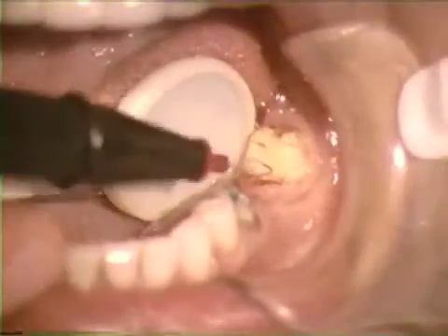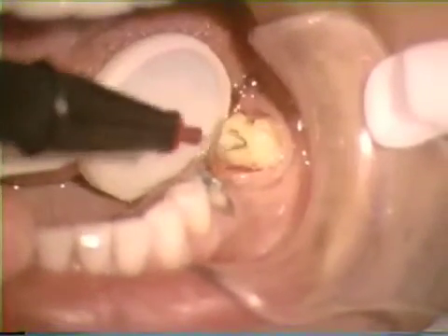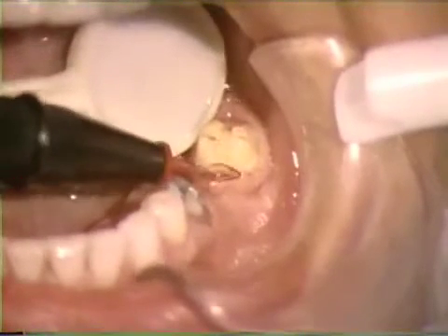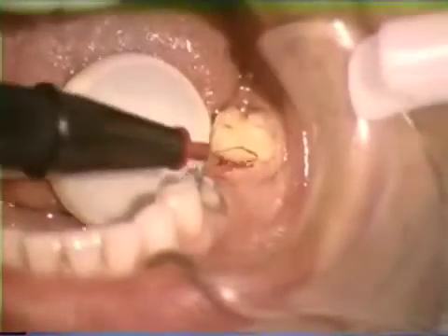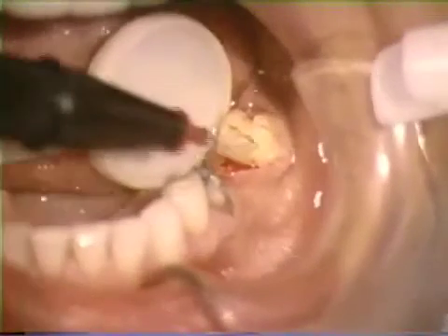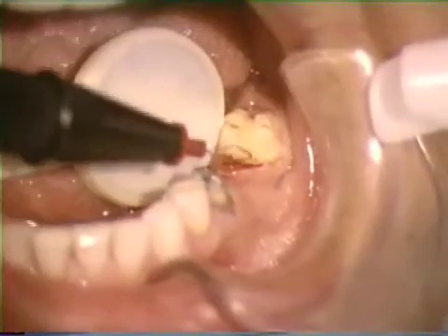Following establishment of the circular trough, the periodontal pocket depth may be decreased using the diamond-shaped electro-tip. Bone contact is sometimes unavoidable, and very short periods of contact — far less than one second — are probably acceptable. When in doubt, locate the underlying bone by puncturing the anesthetized tissue with a periodontal probe. With these principles in mind, the hyperplastic tissue is removed.